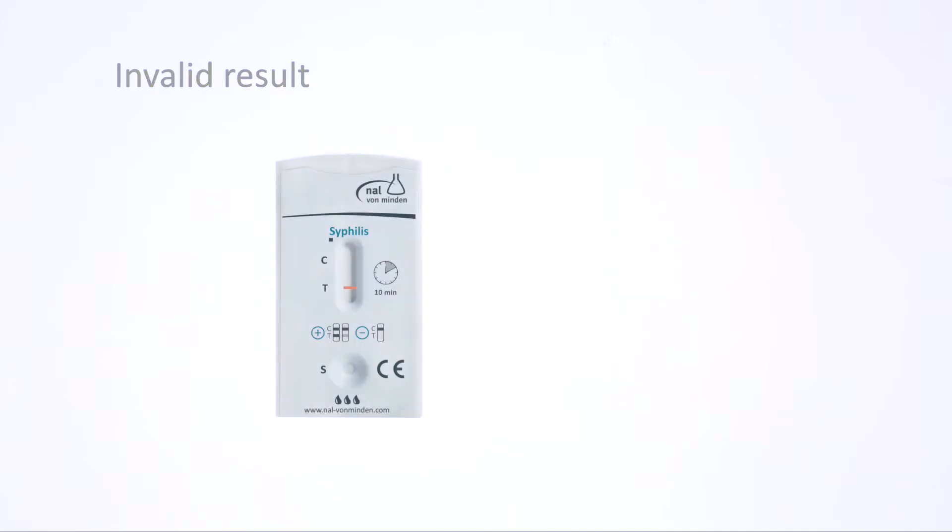The control line signifies that the test has performed correctly and should always be present. If no control line appears, the result is invalid. Repeat the test with a new test device.